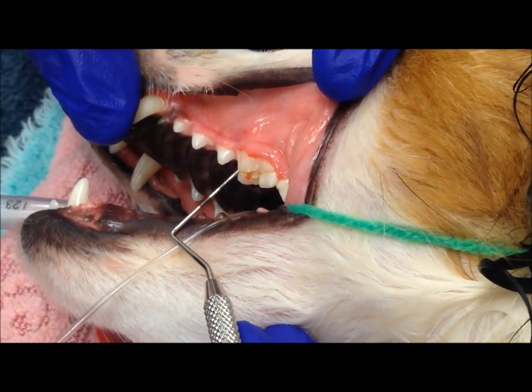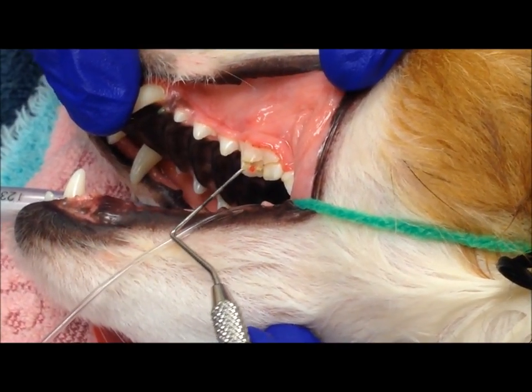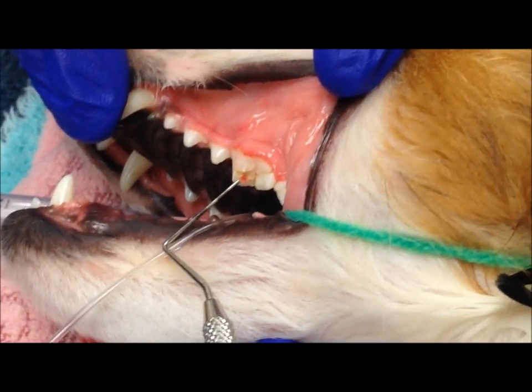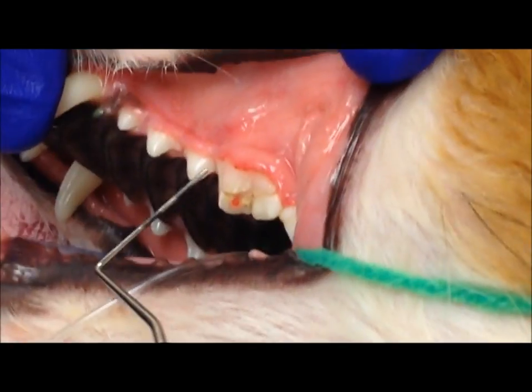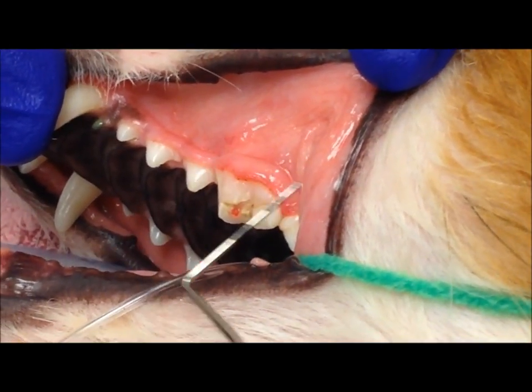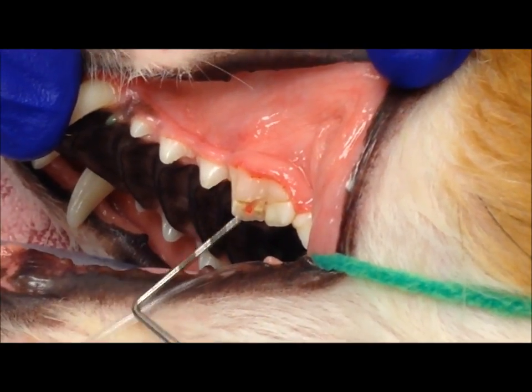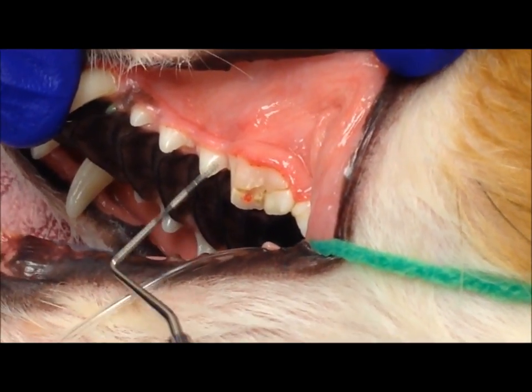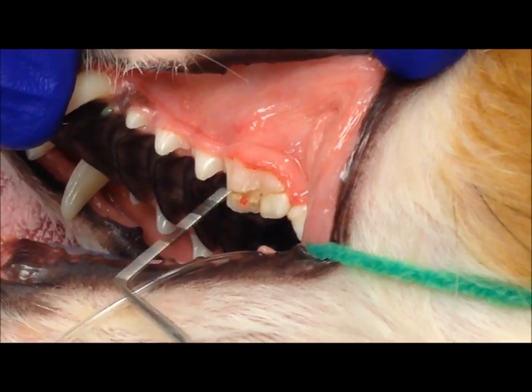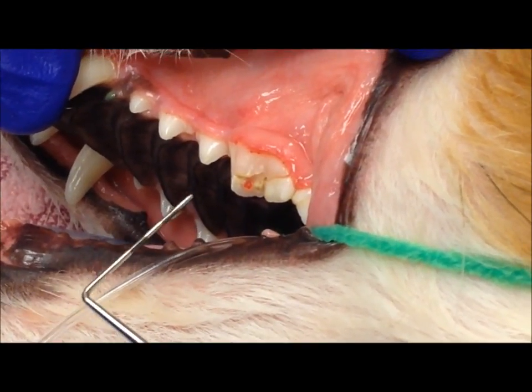As you can see, there's a slab fracture in the side of this upper fourth premolar. This red spot right here is the exposed root canal. In order to remove this tooth, what we're going to do is remove the attachment of the gum here, make two incisions on the gums, and make a flap of gum tissue. Then I'll section the tooth into three pieces, remove some of the overlying bone, and remove each of the roots individually before suturing that flap of gum over the defect.